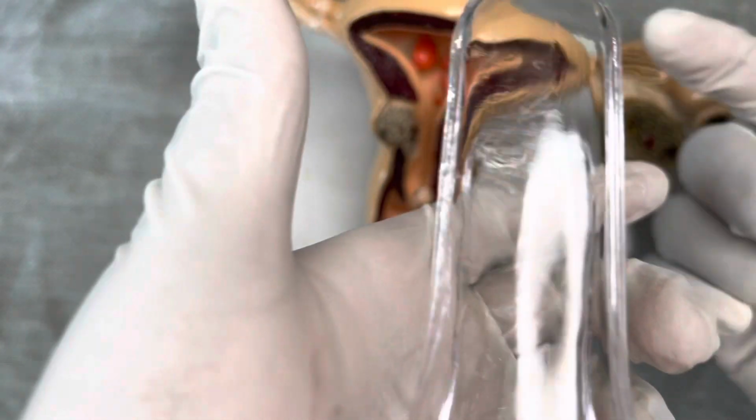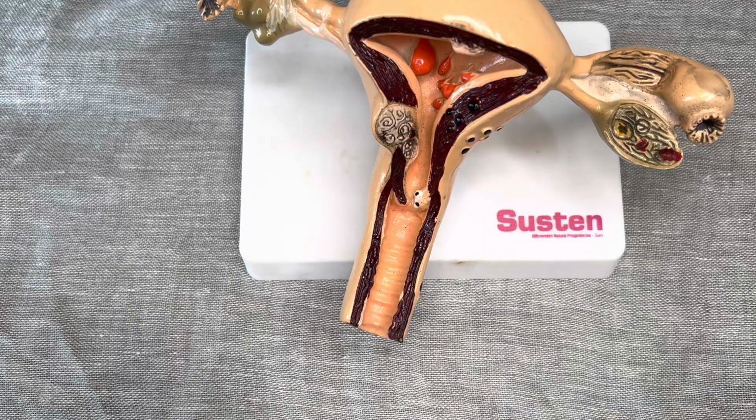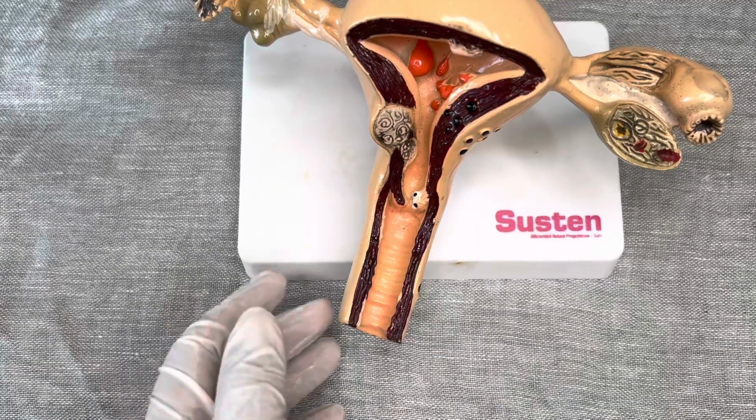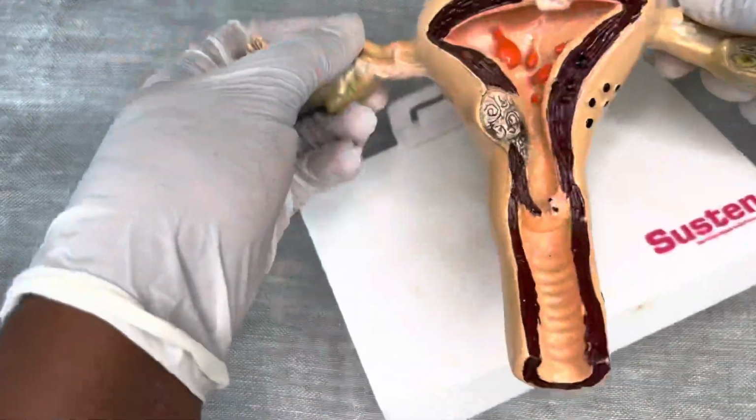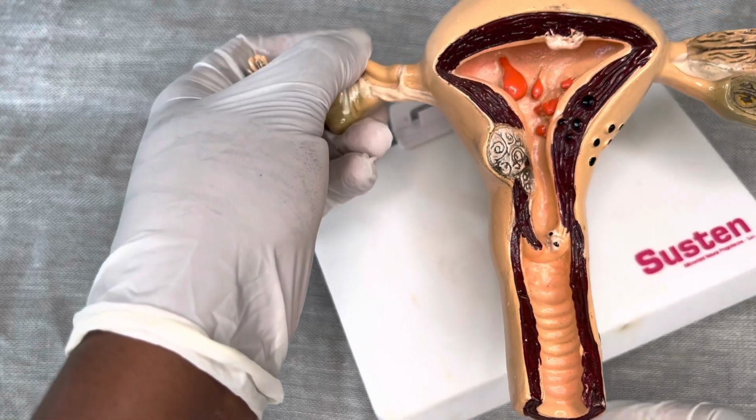You can see once it's fastened while open, now it cannot be easily moved, so you can easily get to see what you want to see from the inside. I don't know if you guys can see that it's now patterned and open. After the speculum is in, you've been able to visualize now your cervix. You can tell exactly where the cervix is.